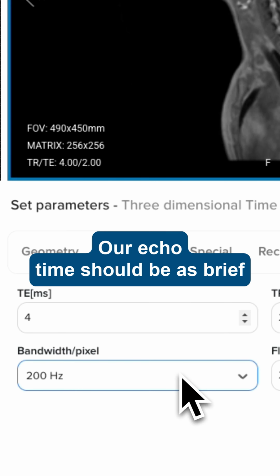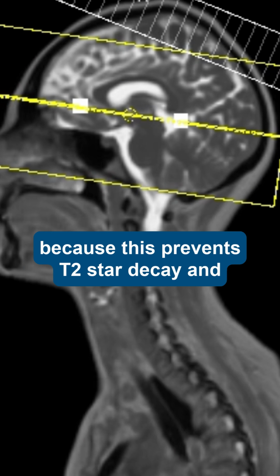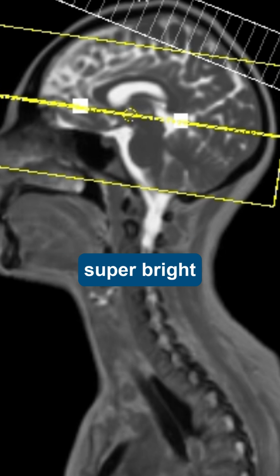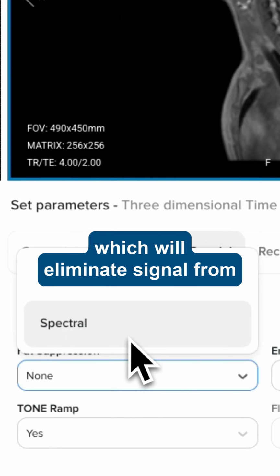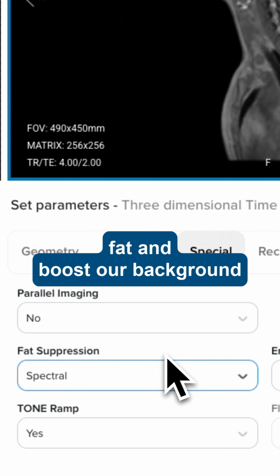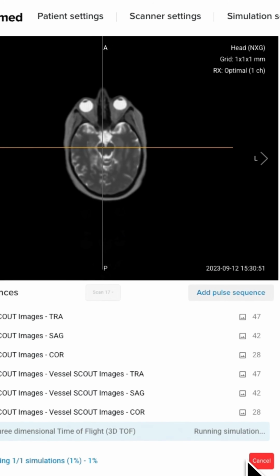Our echo time should be as brief as our hardware allows, because this prevents T2 star decay and makes flowing blood super bright. Finally, we can add fat saturation, which will eliminate signal from fat and boost our background suppression even more. Let's now run this sequence.